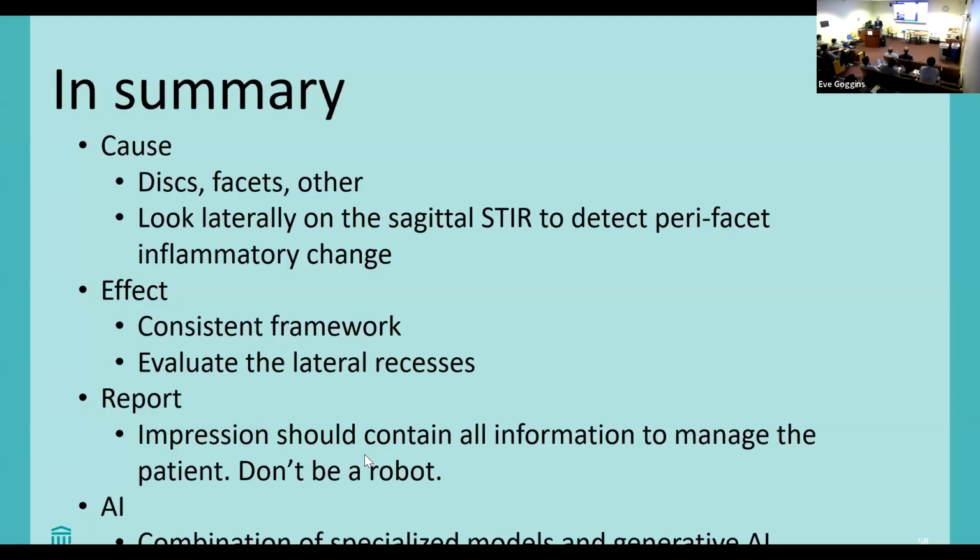And then it looks like there's one other question. It says, is making the distinction between extrusion and protrusion have clinical implications? So I don't know about the difference between extrusion and protrusion. Most of what I've learned here has been from our weekly spine conference with a group of surgeons, including orthopedic and neurosurgeons, and that's kind of how we made this classification. We all did it together.